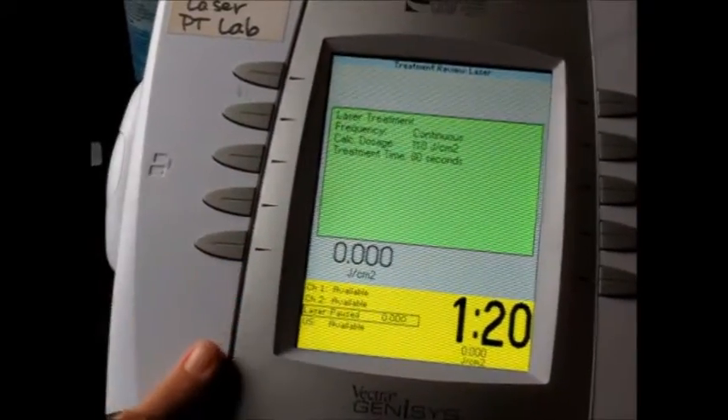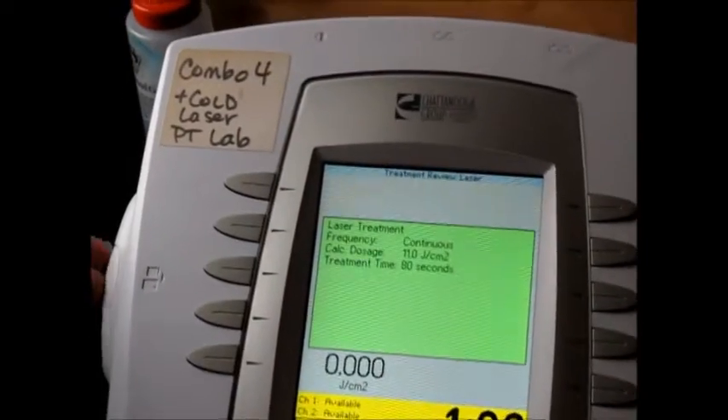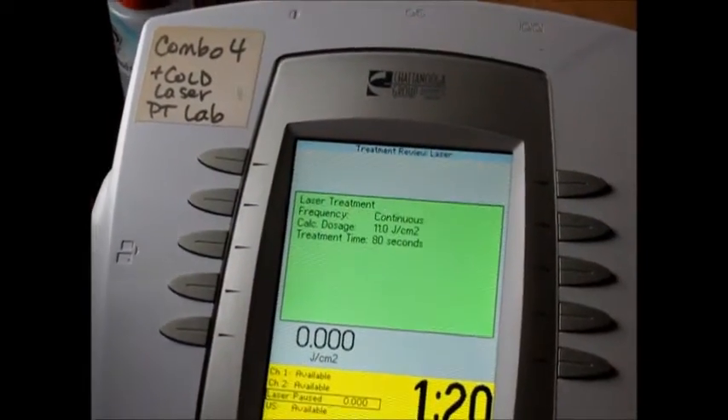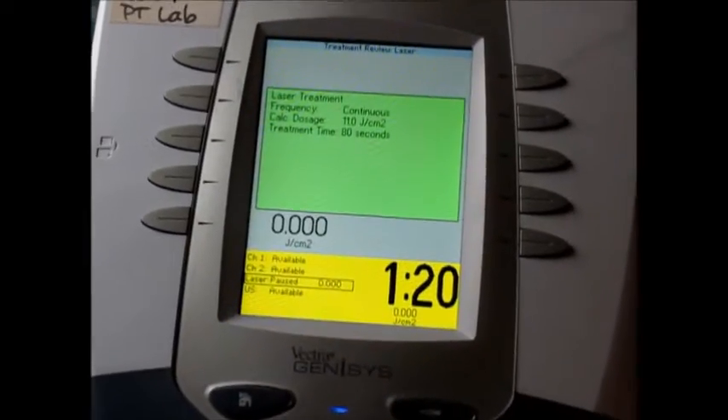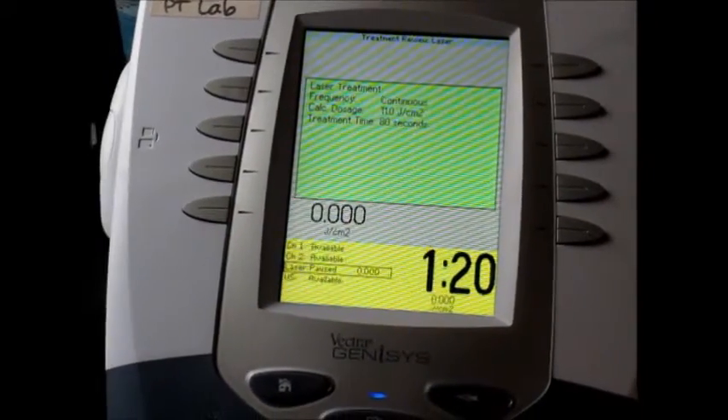This particular unit, by the way, is a Chattanooga. There are such things as patient cards, so you can actually keep an electronic record. You insert it before you work with the patient. It's a pretty neat little tool to use.